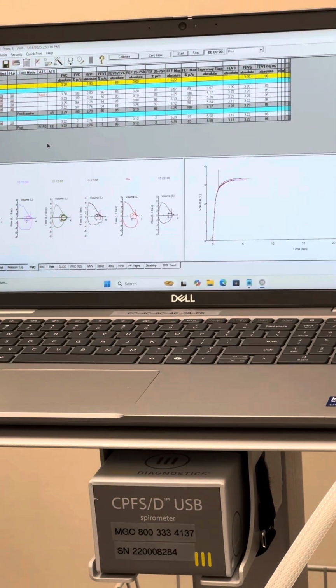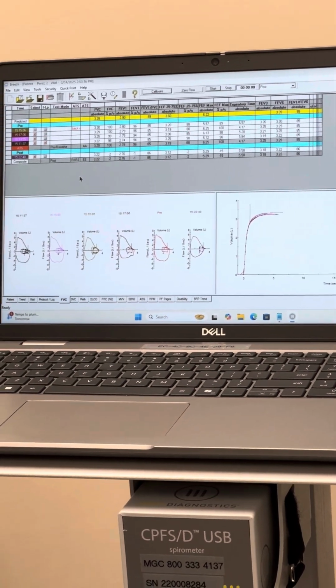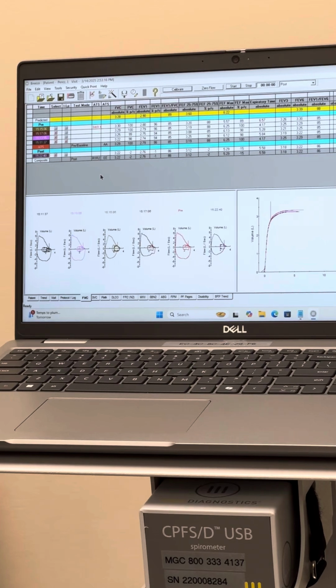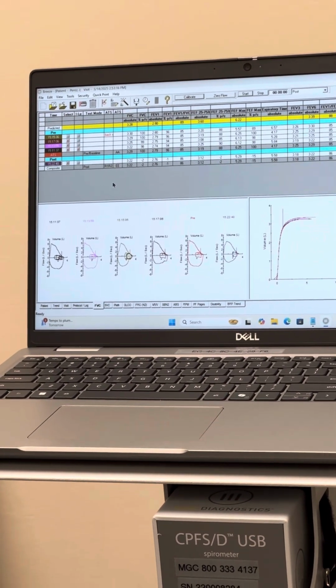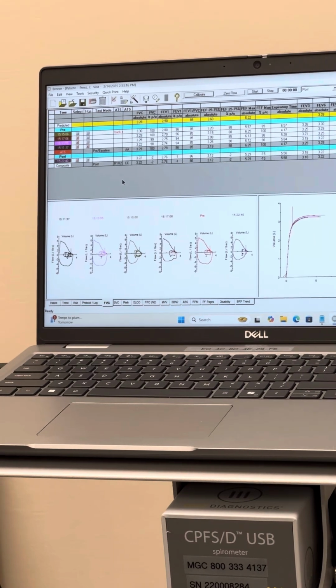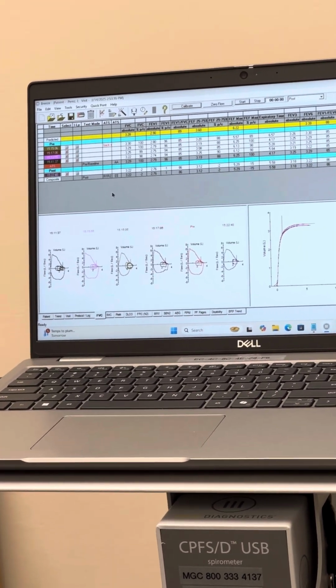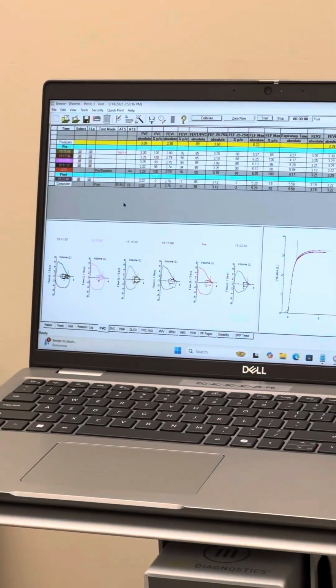I guess my big question is, I can't remember, did you say that once you set all of the settings for the reports, do they stay global across all patients, or do you have to manually input the settings for what gets printed, and do you have to do that for each patient when you create them? You mean when I create a report or when you create a patient? When you create the report? Once I create a report, I'll save it and it will get added to that list, and then it will print the same variables for every single patient.